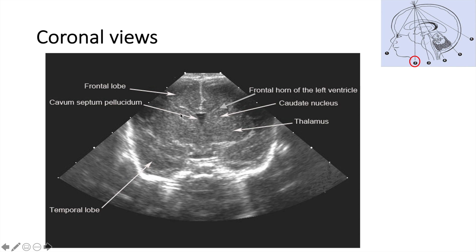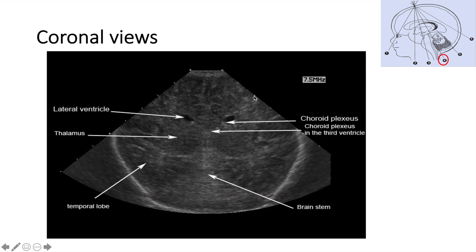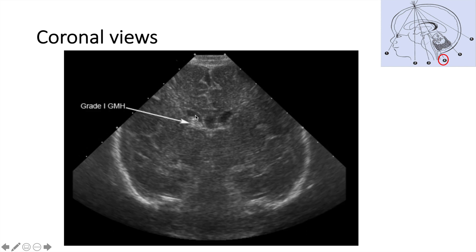Moving backward a little bit, we're starting to see both ventricles — this is the right lateral ventricle and this is the left lateral ventricle. You can still see the caudate-thalamus on each side, and the dark structure in the middle is the cavum septum pellucidum. Moving backward further, you start to see the choroid plexus on each side. This is how grade one IVH looks on the coronal view — you can see bright clot here.